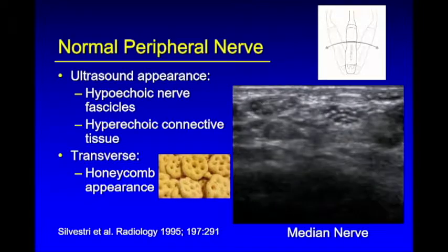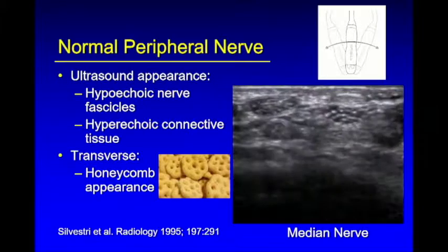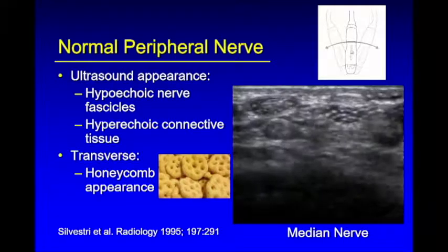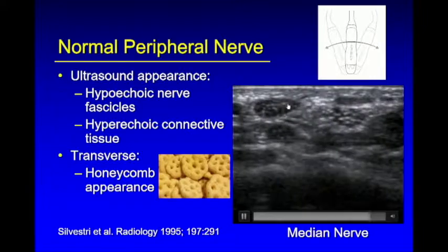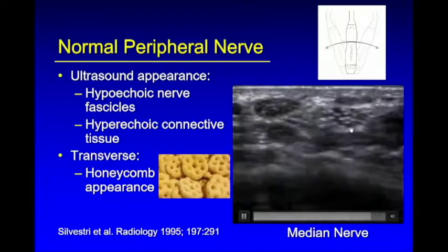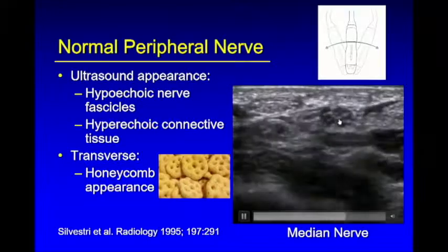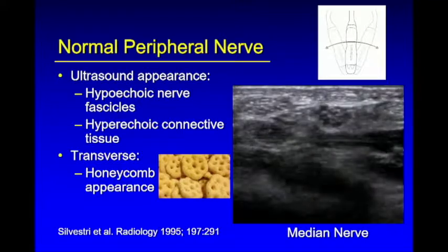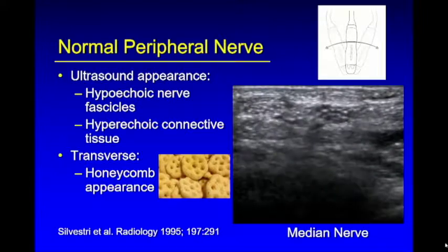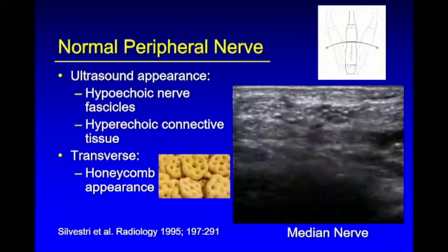As you move the transducer proximal to distal, you'll appreciate the tubular configuration of the structure. Looking at the carpal tunnel, I'm toggling the transducer to bring out anisotropy of the tendons. Anisotropy also involves the nerves, but to a much lesser degree because the nerve is already hypoechoic — it's really the echogenic epineurium that decreases with anisotropy. By toggling the transducer, you can bring out these echogenic layers to show that honeycomb appearance.